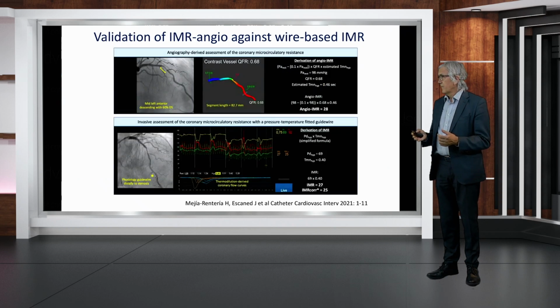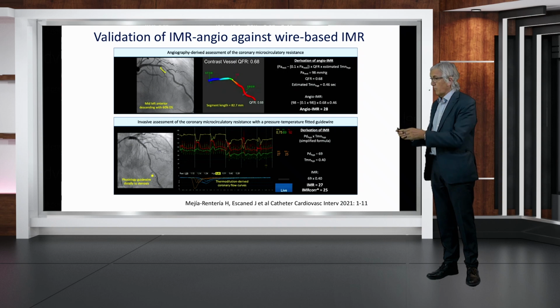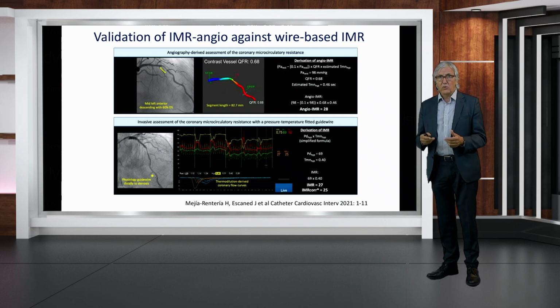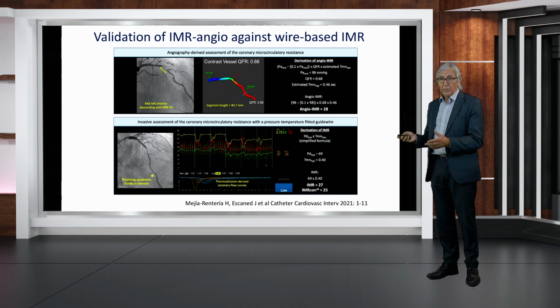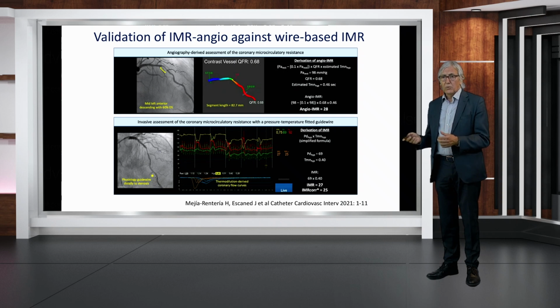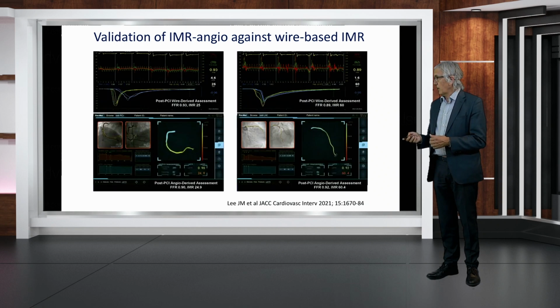More recently, the use of functional coronary angiography has been expanded to interrogate also the coronary microcirculation, and it has been demonstrated that you can obtain information on microvascular resistance, which is actually comparable or similar to that obtained with intracoronary pressure guide wires. And there is a hope that these tools will also facilitate measurements in patients that have, for example, ischemia without obstructive coronary artery disease.